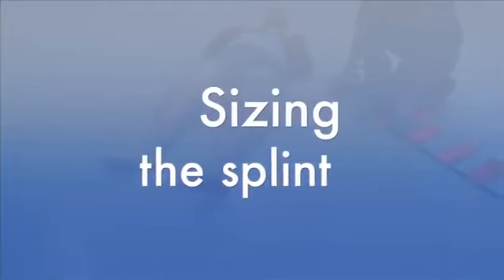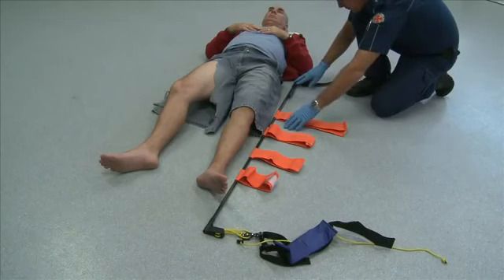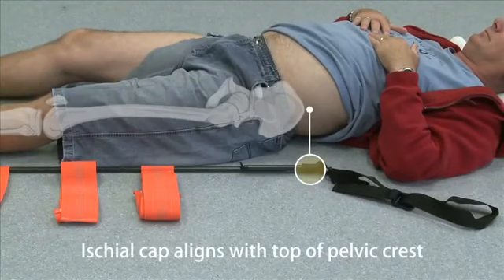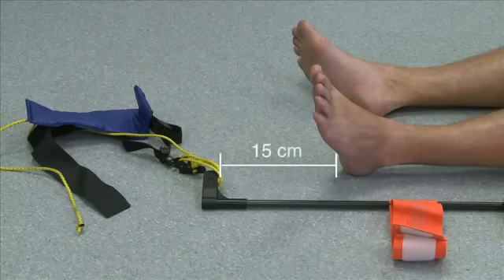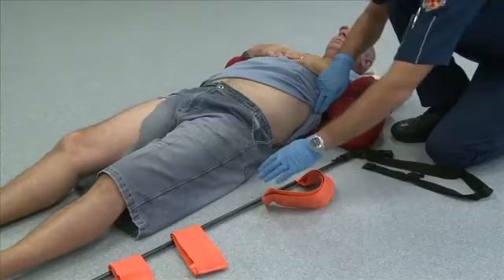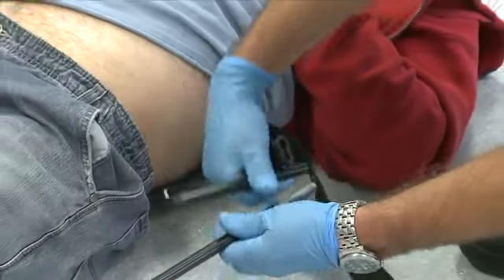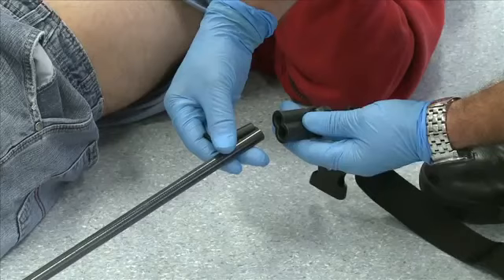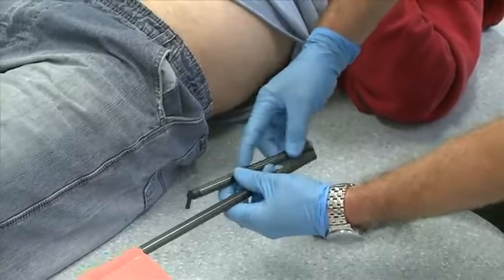Step 4 Sizing: To gauge the correct length, place the unit alongside the uninjured leg. The ischial cap should align with the top of the patient's pelvic crest, with the ankle hitch end approximately 15cm beyond the bottom of the patient's foot. Step 5 Adjust Length: If the splint appears too short or too long, tube sections should be added or removed as necessary. Here the correct size is accomplished by removing the ischial cap and one piece of tubing folded back.